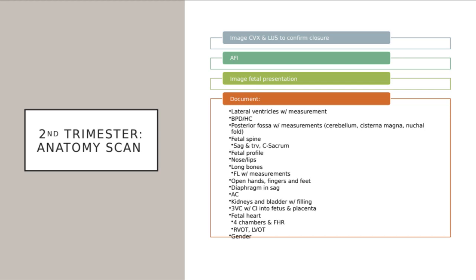And then as for our fetal heart, now remember, we are not going to be doing a full in-depth evaluation of the baby's heart. If we see something abnormal with the basic views, they're going to be sent for a fetal echo. When we are looking for our heart, we need to make sure that the apex of that heart is pointing up. That's going to be the best way that we can get the 4-chamber view. We want to make sure that our chambers are looking proportional to each other. We know our ventricles are going to be triangular in shape, and then we know our atria are going to be a little bit more rounded in shape. We are showing that 4-chamber heart nice and equal, and then we're also doing M mode for fetal heart rate.